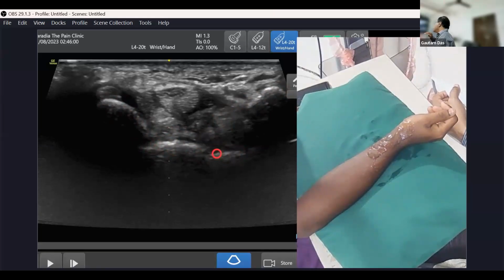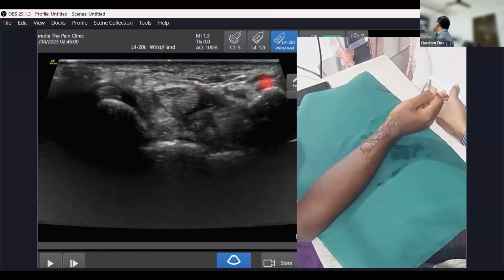So first when we were talking about the carpal bone, they were projecting. And this is your flexor retinaculum, roof of the carpal tunnel. So there is one tendon here. What is that tendon? Flexor carpi radialis. There is another tendon here, that is your flexor carpi ulnaris. So this is the radial artery.